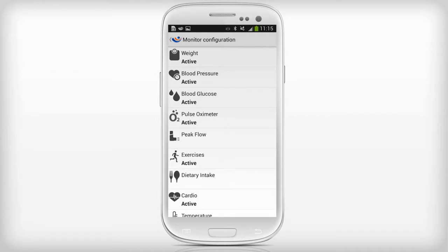You can see which monitors are active on the monitor configuration screen. Press return to go back to the main screen.